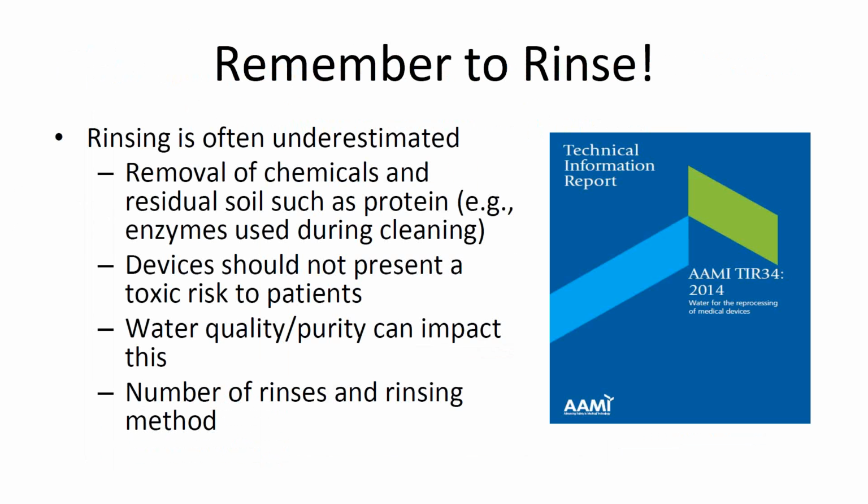If the debris and the chemicals are not removed from the endoscope, it does present a risk to patients and a risk of one chemical interacting with another, because remember, we have yet to submerge the endoscope for disinfection. So this is just the detergent that we've worked with up till now. So we do need to remove the chemical and the soil that we've loosened during brushing prior to moving on to disinfection.